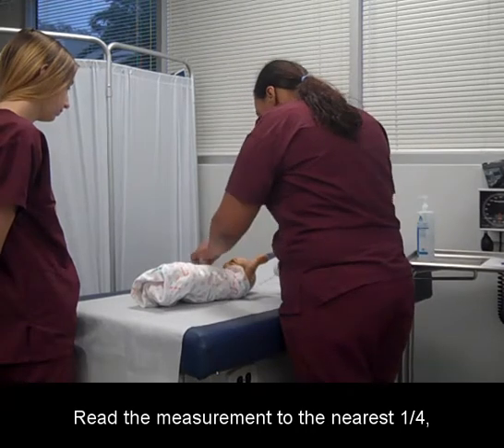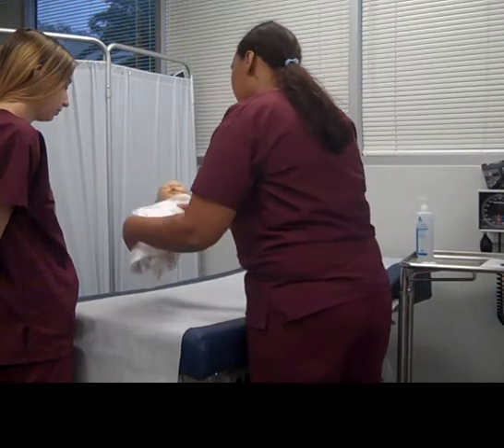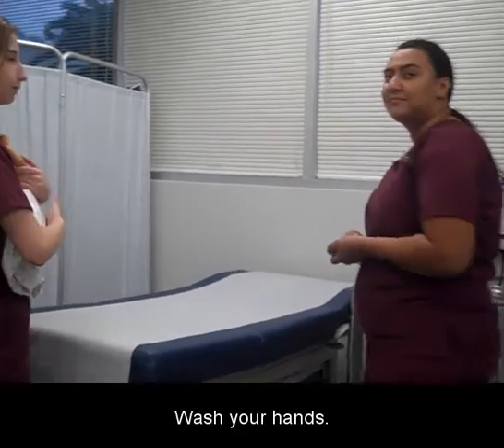Read the measurement to the nearest quarter, half, or three-quarters of an inch. Gently give back the infant to the caregiver and document the results. Wash your hands.